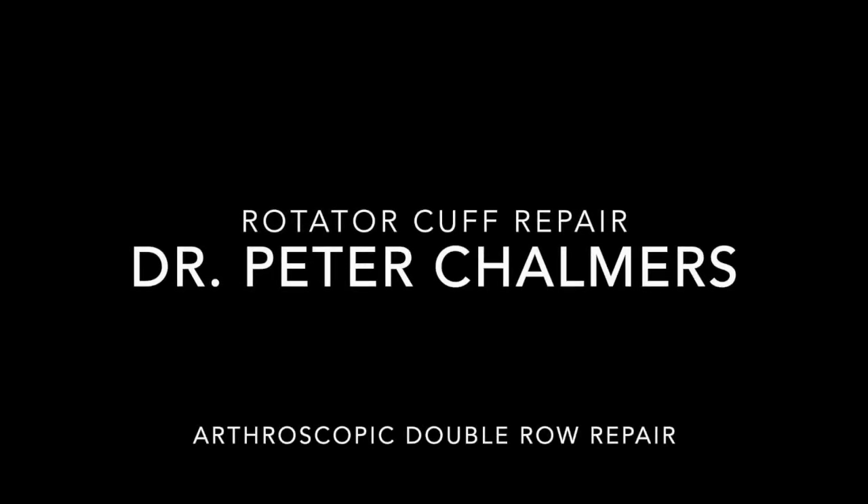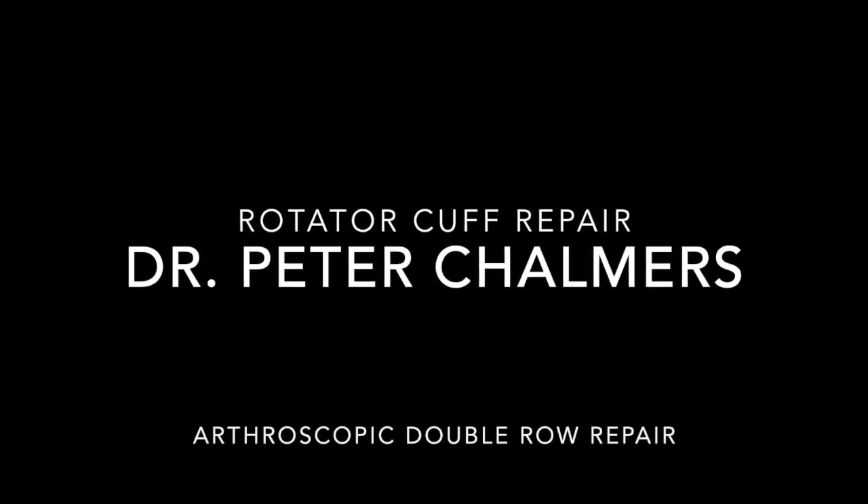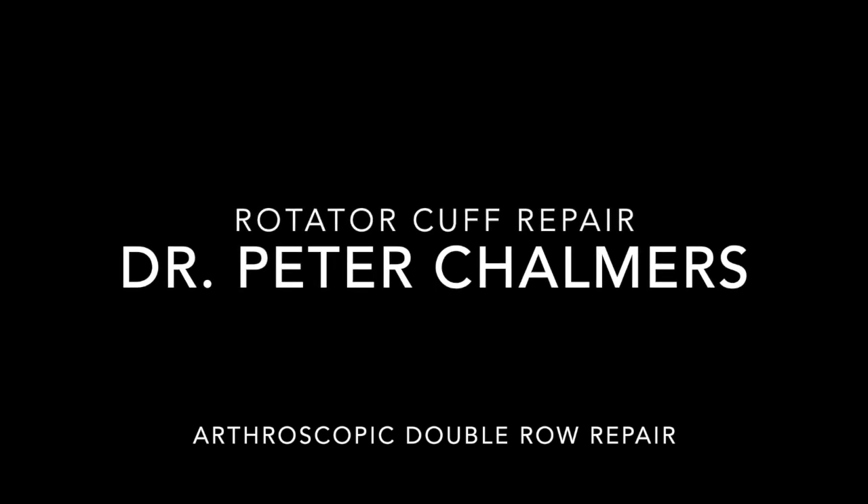Hello, my name is Peter Chalmers, and this is my video on arthroscopic double row rotator cuff repair. For me, this procedure is performed in the beach chair position.